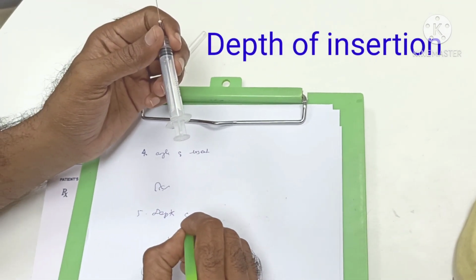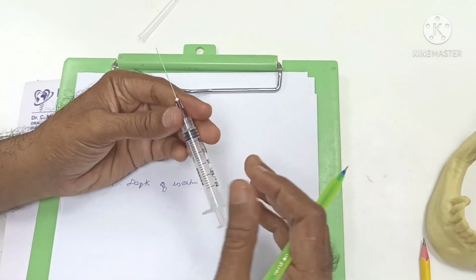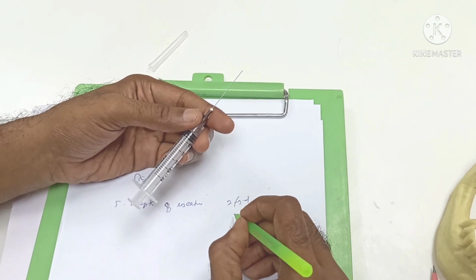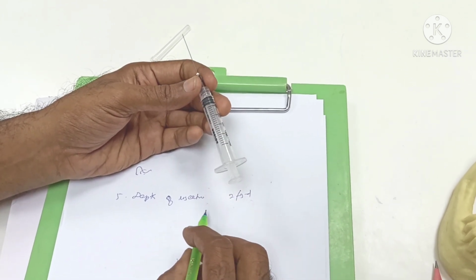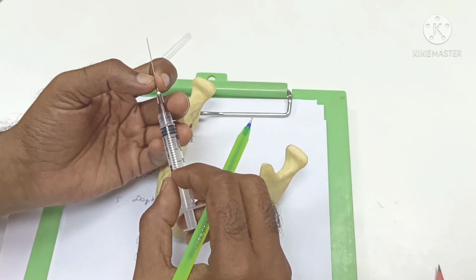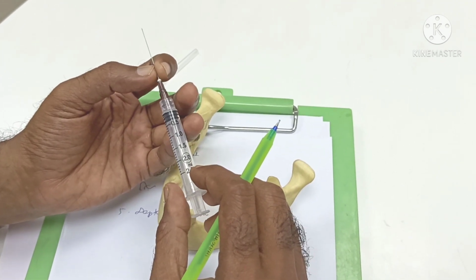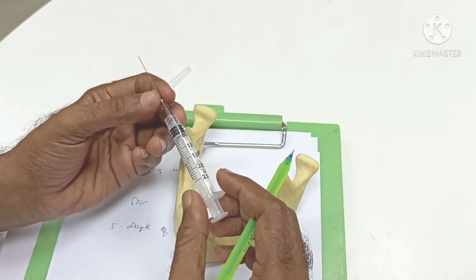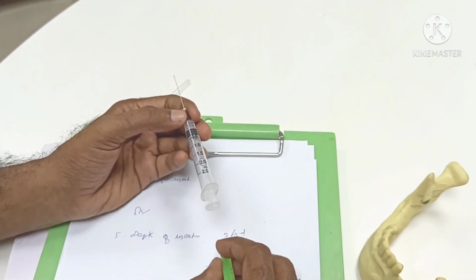So the fifth point is depth of insertion. As I already told, for a long needle it should be around 2/3, and if it is a short needle, the entire needle will go inside. When you use a long needle and you have entered about 2/3 of the needle, then you can inject. At this moment you might have felt bony contact. Even if you have not felt any bone contact, that is not an issue. You can aspirate and deposit the solution.